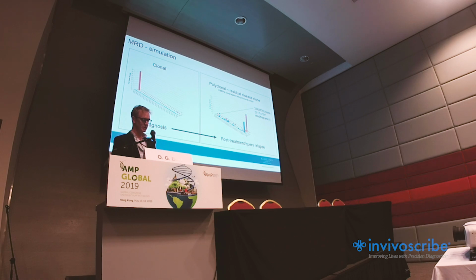This is just an example of the diagnostic sample. Or you can imagine this would be the diagnostic sample. This is the clonal control that we spiked into a polyclonal control, and you can see at the lowest dilution, 0.005%, the clonal sequence was identified in 33 reads out of the 600,000, and that gave us a frequency of 5 × 10⁻⁵.